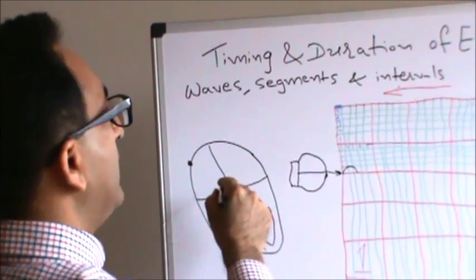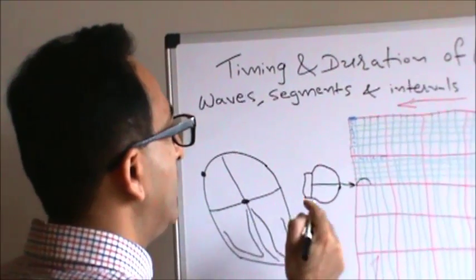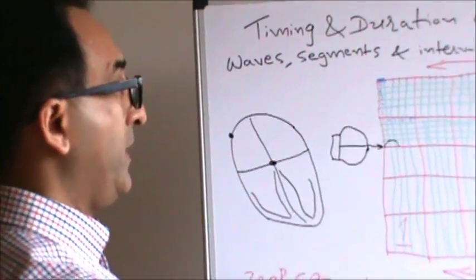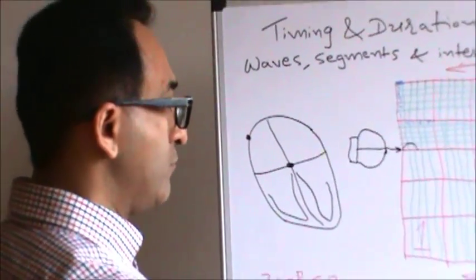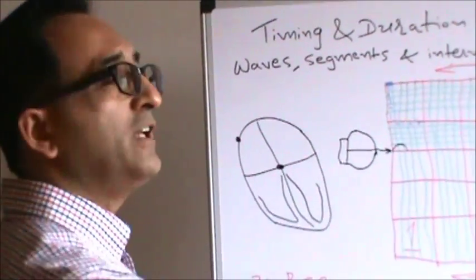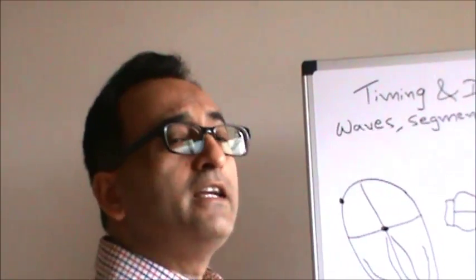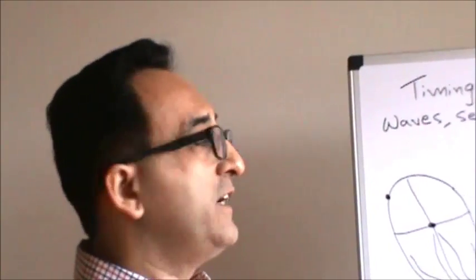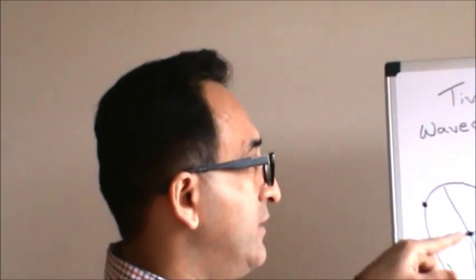And then the heart is silent in the AV node, so there will be an isoelectric line we call the PR segment. You know that now. So that PR segment again is another 2.5 on average, another 2.5 small squares.